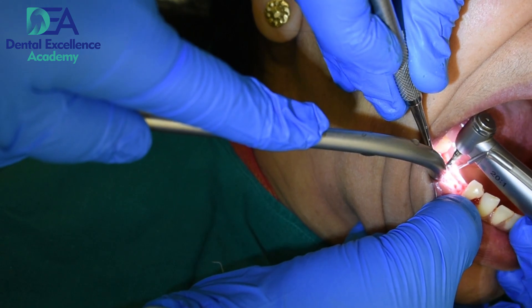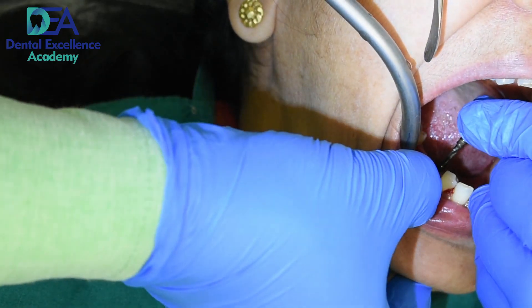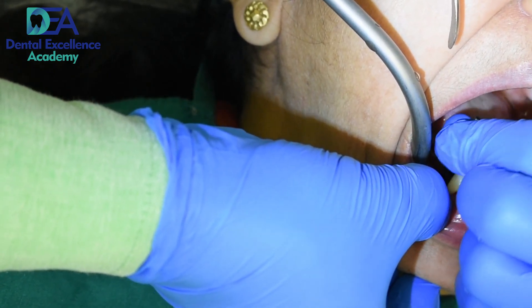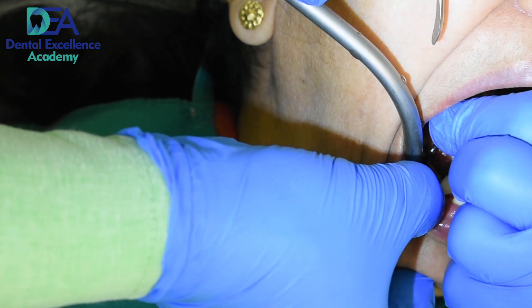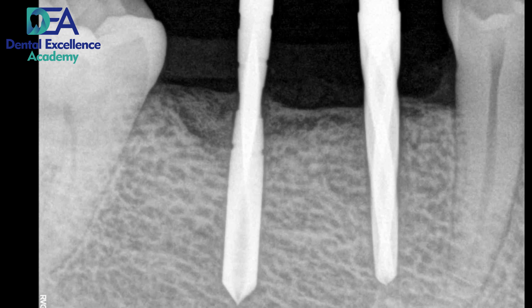These are the initial drills. Now I am checking for parallelism and the position of the implant. This is the first radiograph and you can see we are almost parallel to each other and to the adjacent tooth as well.